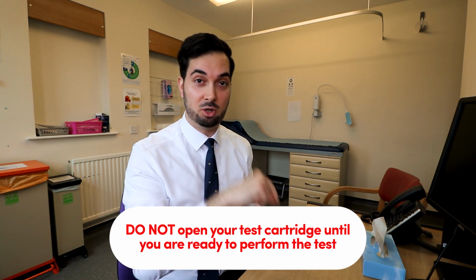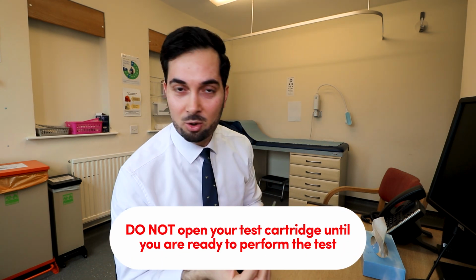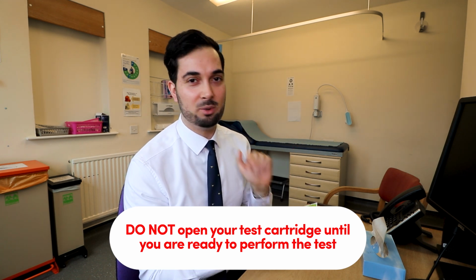Please do remember though, when you open this test cartridge, there's a reason it's sealed, because as soon as you open it, it only really lasts half an hour, so it gives you half an hour for you to put your solution on there, okay? So if you're going to be a while, don't open this until you actually need it, otherwise you're going to waste the cartridge.